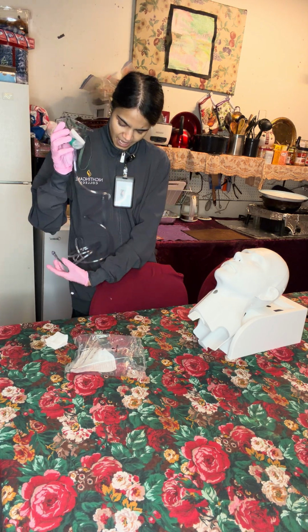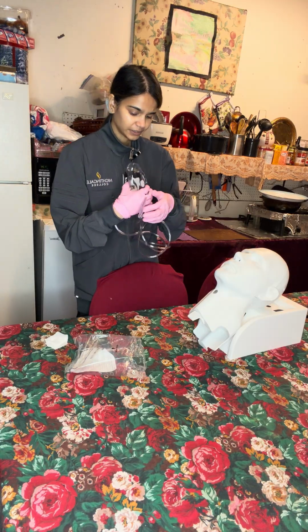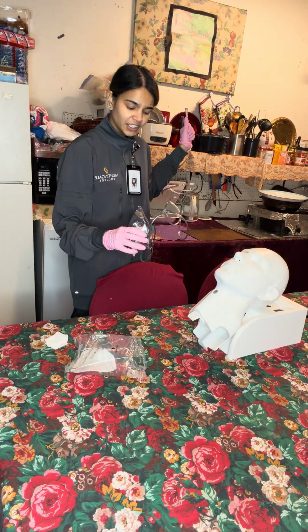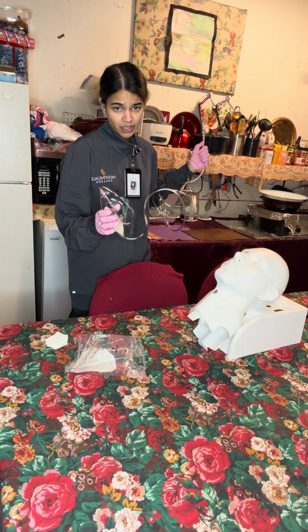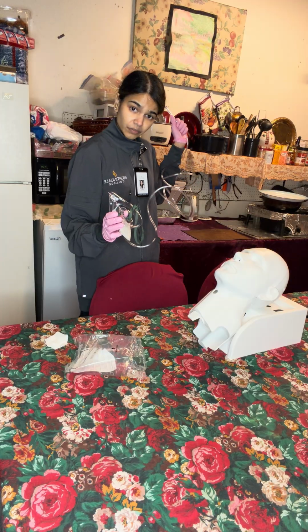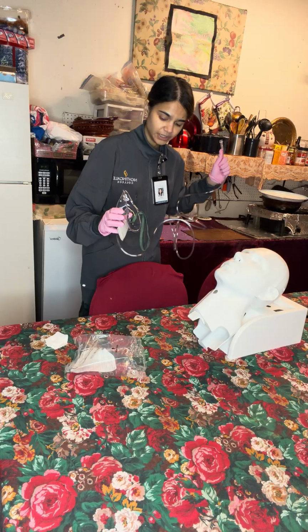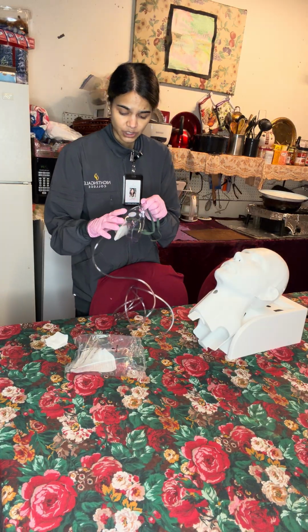I will first attach the end to the flow meter, and the doctor has ordered for us to administer 6 liters per minute. And I would adjust the flow rate on the flow meter to the prescribed doctor's orders. And then I would apply the mask onto the patient.